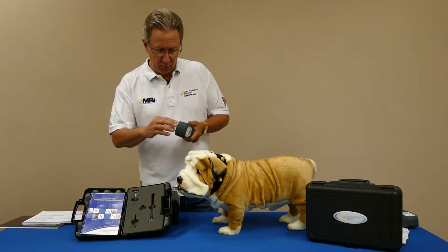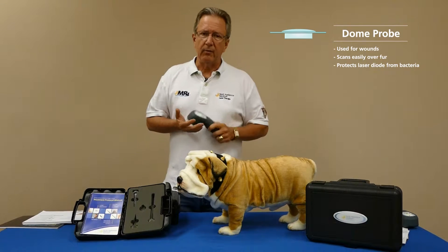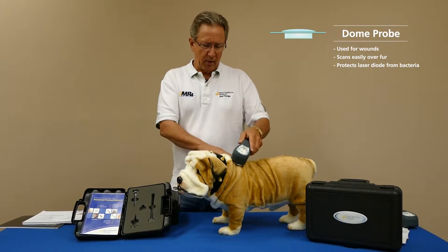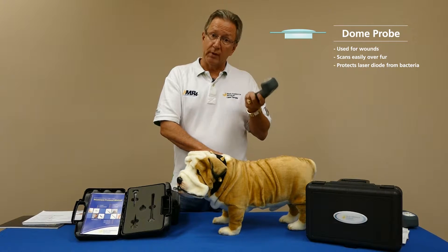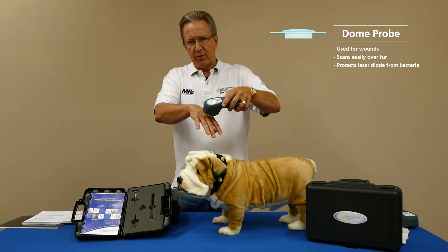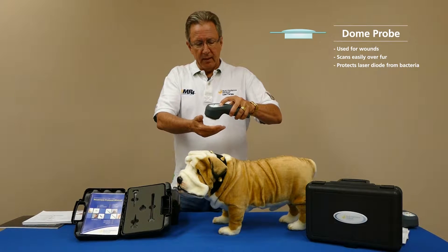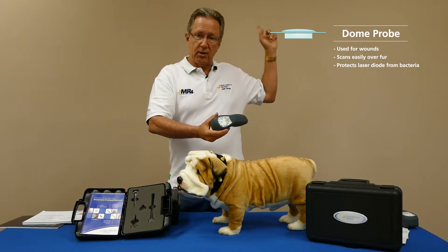The easiest one to start with is the wound probe — they all thread right onto the front very easily. This comes in handy when you're working on a wound where you don't want to disturb the tissue bed and want to reduce contamination issues to a minimum. It's also wonderful when treating arthritis, where you want to get some ease of motion and reduce friction — I call it the dome probe in that case. For wounds, you're just hovering about a half inch over the surface; with a wound there's no skin barrier, just open exposed flesh. You can see up here — that's our dome probe.